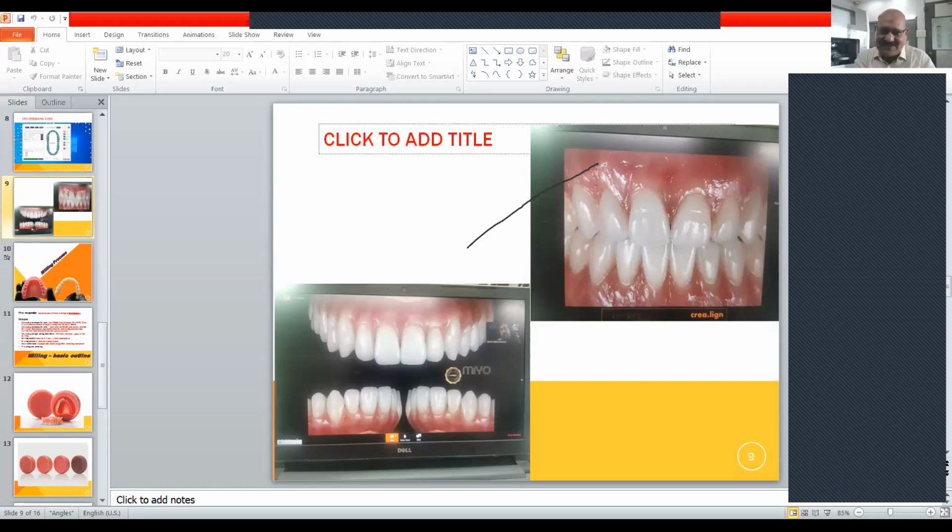Drawing an analogy, if a patient can afford it, fine. But a clinician has to justify the cost and find the right suitable condition. Now is the time we can take the impression and go for these CAD CAM dentures. But as long as the tissues have not settled down, you are absolutely right, madam, that we have to appreciate those conditions and take a very wise decision.